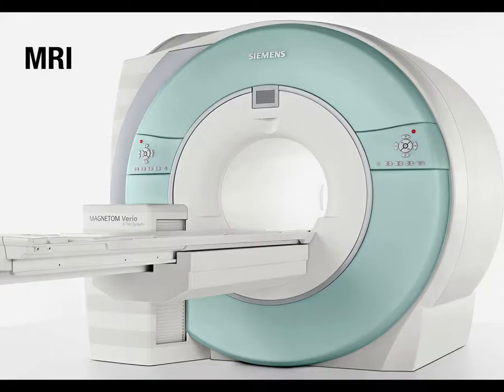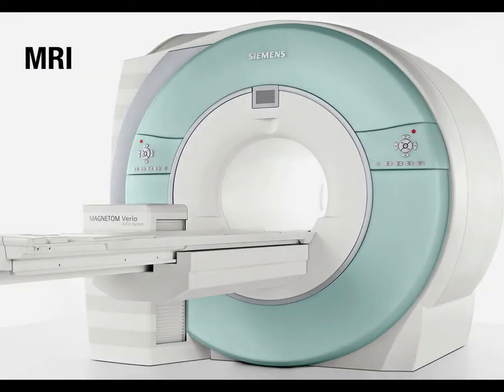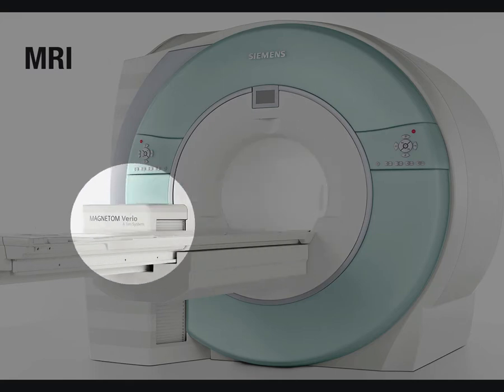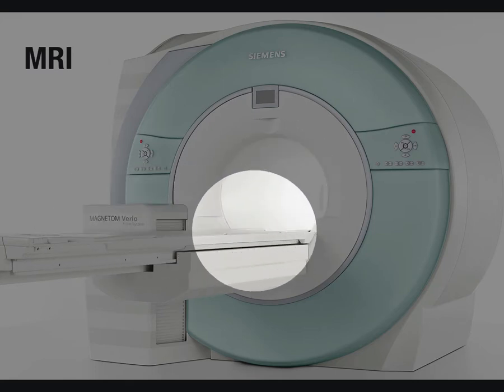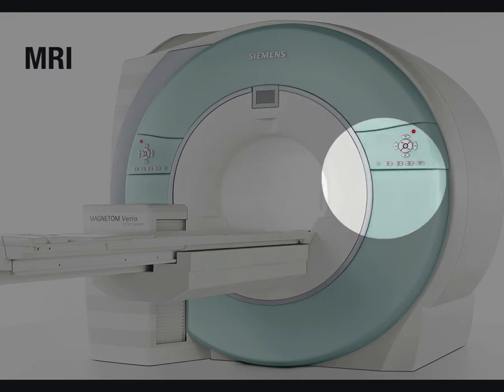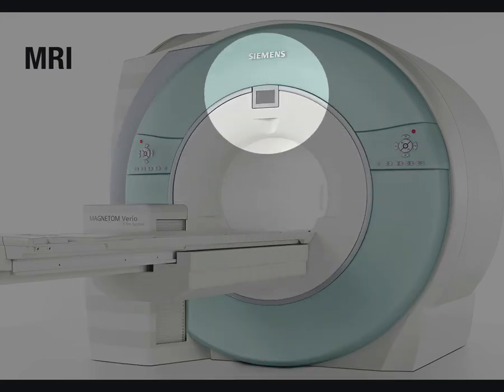So that's what an MRI scanner looks like. It's a big plastic donut, and critically inside that scanner, so we would call, it's not quite oriented right, we would call that the bore of the scanner, where the subject lies. So the subject, or the patient, would lie on this bed. For a head MR, they'd have their head inside that bore, that tube. And the main part of what's around them is a very strong magnet.